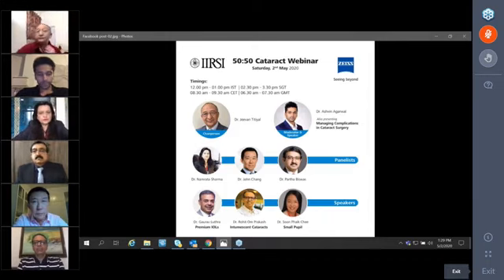Okay, so first of all, I clarify I'm an anterior segment surgeon. But anterior segment surgeons can also learn these approaches, right? Because it involves the cataract. So I do encounter cases of phacomorphic glaucomas, especially when you have also lens subluxation due to weak zonules. So the lens can be really very anterior, and in addition, it can be extremely thick. Patients who are post-angle closure glaucoma don't come to you until we see lenses that are over 6 mm thick.